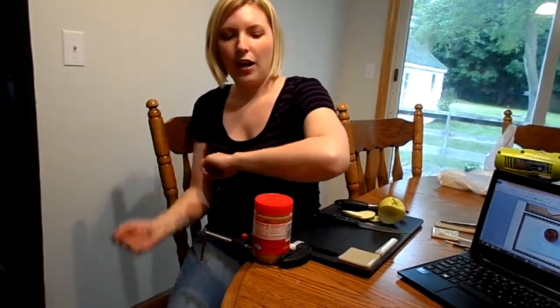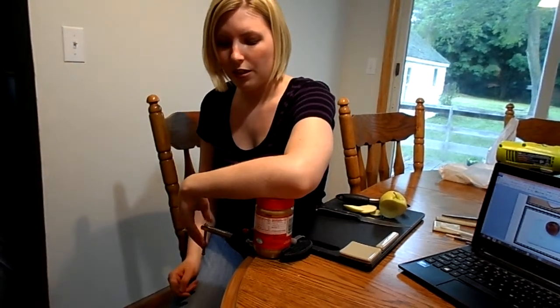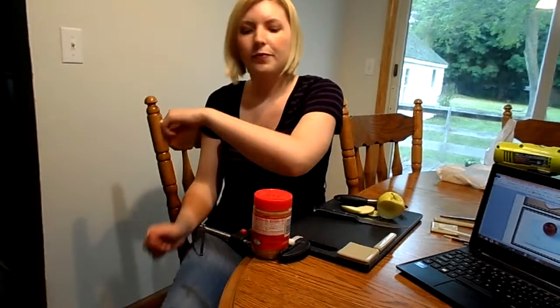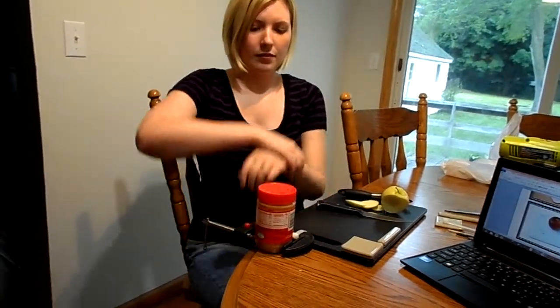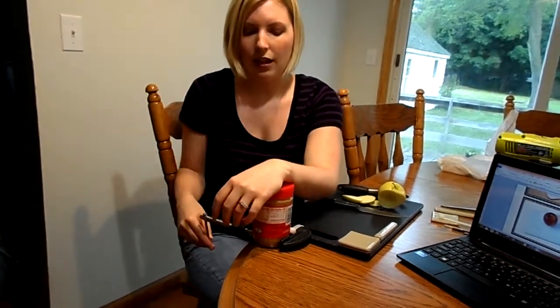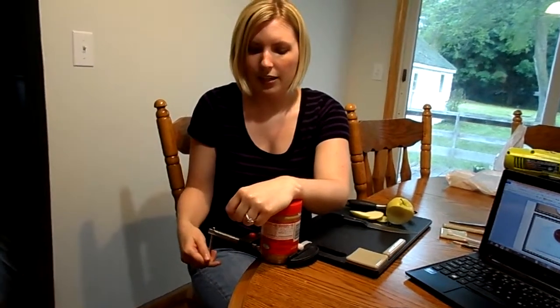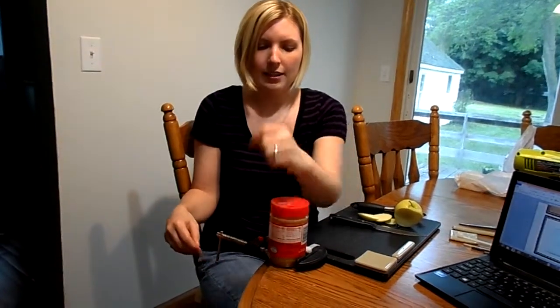So to do that, I can take my unaffected arm and place my affected arm on top of the peanut butter. Or if I only had maybe my left arm, I could just secure the peanut butter with my elbow and turn this clockwise with my hand. So then I just take the clamp handle and I'm going to go ahead and clamp the peanut butter jar tightly in there by turning clockwise. And now that it's secure, I can open it with one hand.